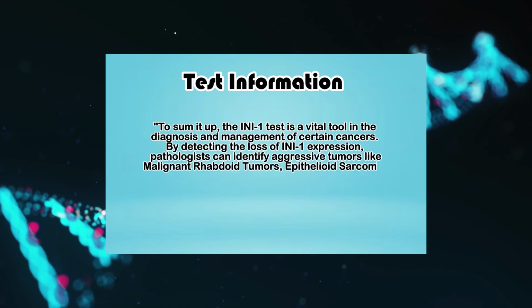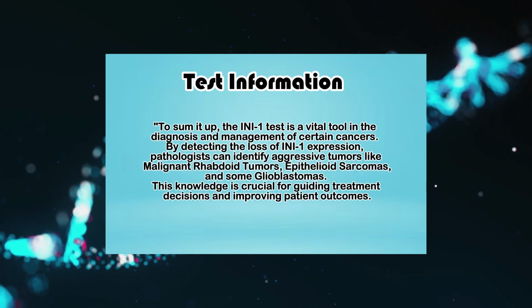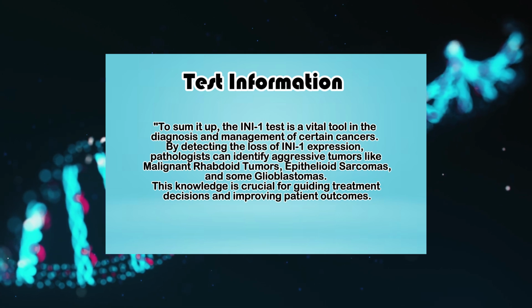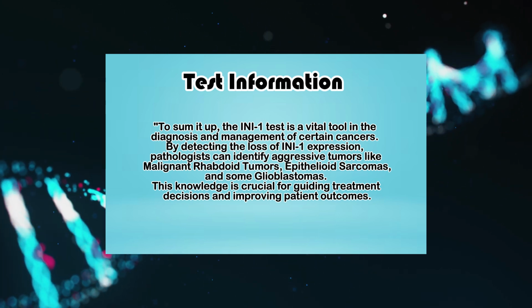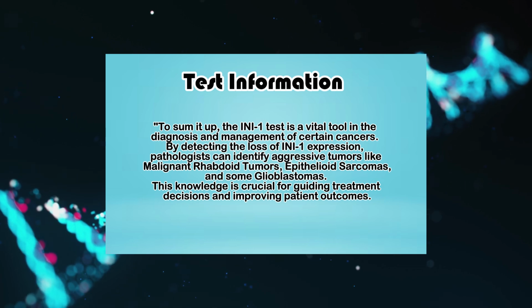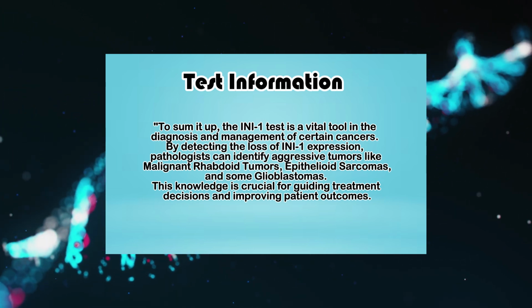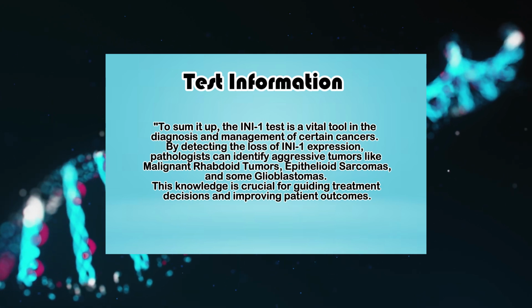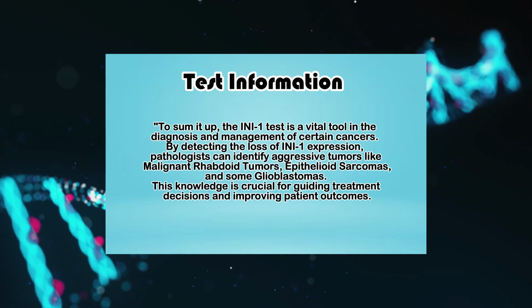Test information and conclusion. To sum it up, the INI-1 test is a vital tool in the diagnosis and management of certain cancers. By detecting the loss of INI-1 expression, pathologists can identify aggressive tumors like malignant rhabdoid tumors, epithelioid sarcomas, and some glioblastomas. This knowledge is crucial for guiding treatment decisions and improving patient outcomes.